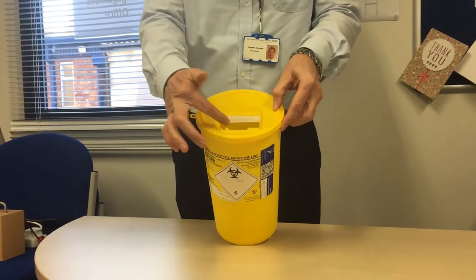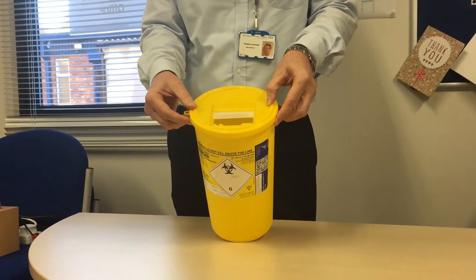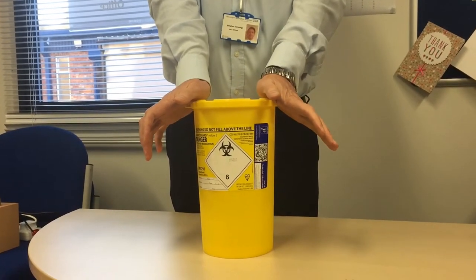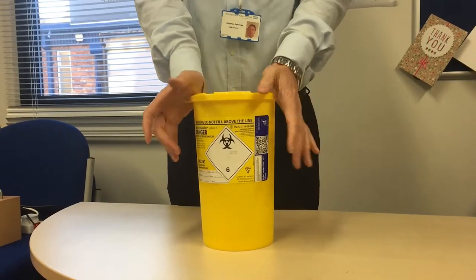Once you're happy with that, place the lid on top of the sharps bin, then push down on a firm base and make sure you hear a click. When you hear a click, you understand that the lid is sitting properly.